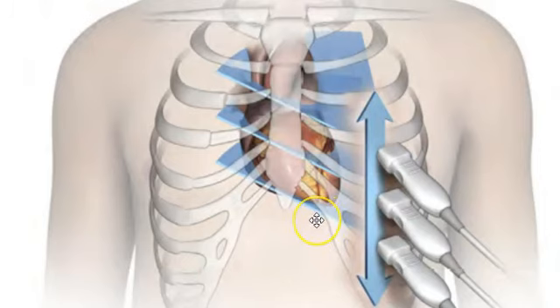So we have to make adjustments as sonographers to the best presentation of what we're trying to see, and the reading doc understands that once they know that we're competent in what we do. If we don't get the perfect image, or we have to cut off the apex a little bit, they understand this was a tough scan. They just couldn't get into that window.